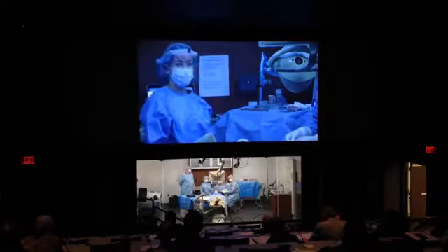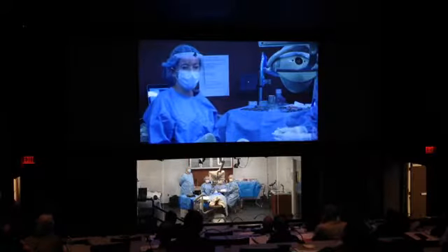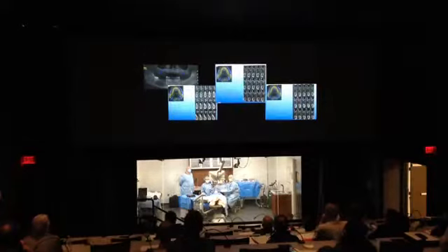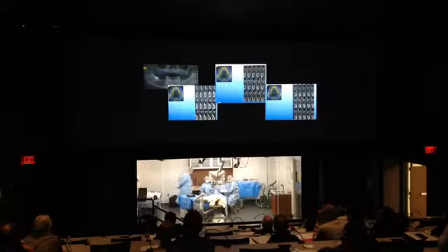So you see up there on the screen, we have a CT scan of the patient, which is now the standard of care for these procedures. On the panoramic image, we could see there, I took some measurements. So we have plenty of bone. The sinuses come far back enough posterior, so they're not a problem. Sometimes we see the sinuses coursing all the way up to the canine. And you can see hers are actually probably around the second premolar.